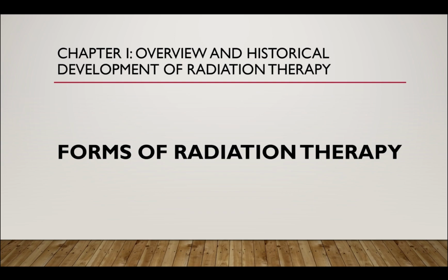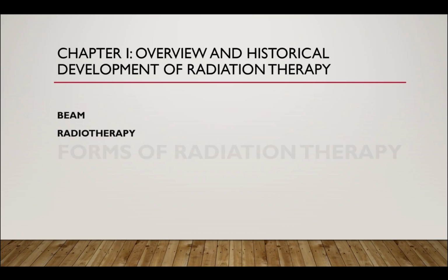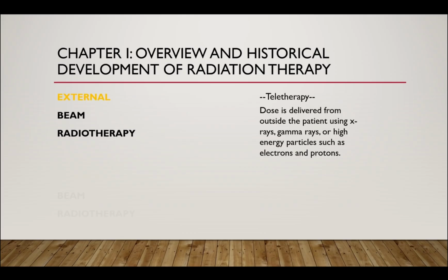Okay, in radiation therapy, we have two basic forms. These forms actually only differ in the method of delivery of radiation. So in the forms of radiotherapy, we are considering the relationship of the patient to the radioactive source. So first, we have the external beam radiotherapy and the internal beam radiotherapy.